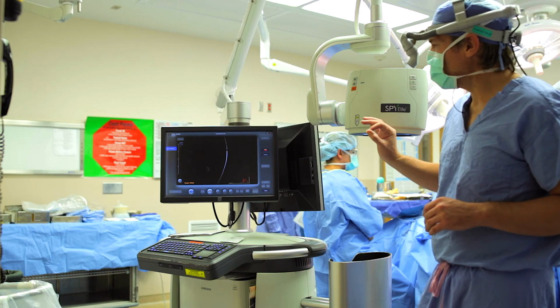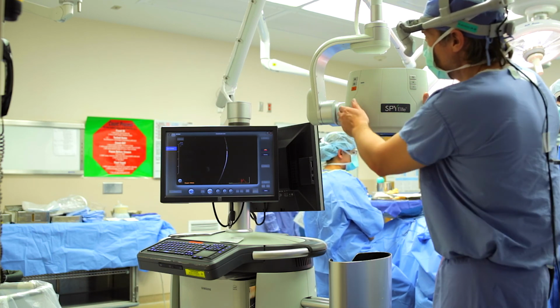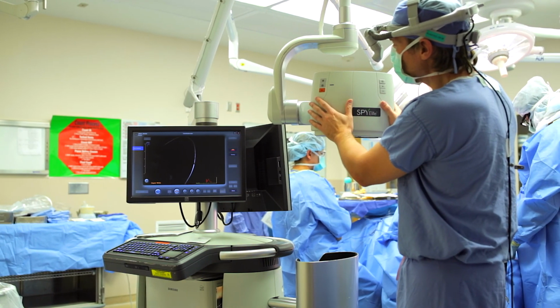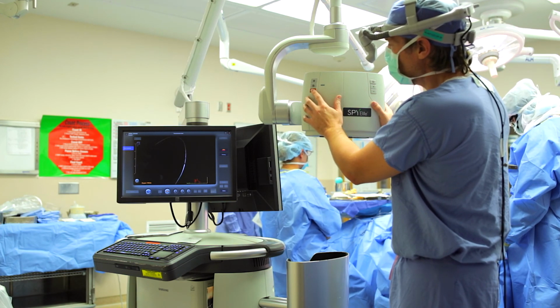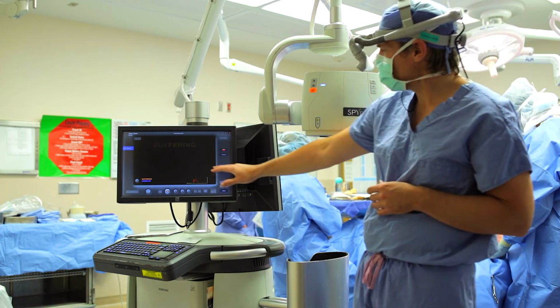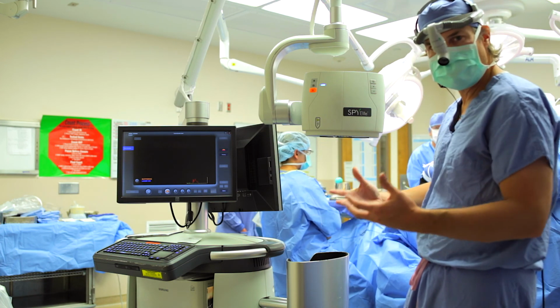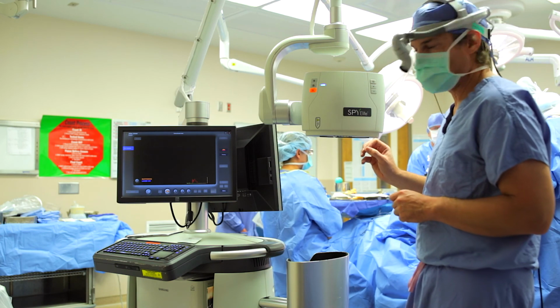To turn on the laser, or to activate the machine to do a SPY study, how we do that is through this handheld remote, or through this port. There's this orange button here, and then pressing that once is going to activate the laser, and it's going to flash orange, and on the screen you're going to see buffering. What that means is the laser's turned on and you're gathering information. You can see it, but you're not recording it at this point.